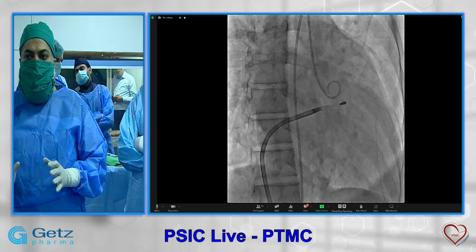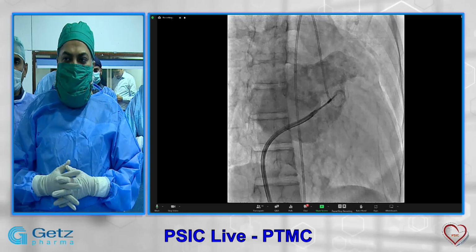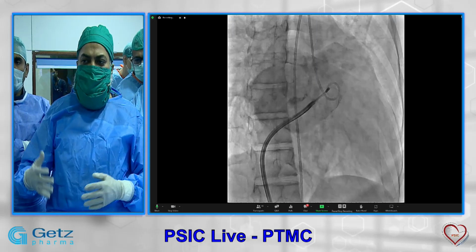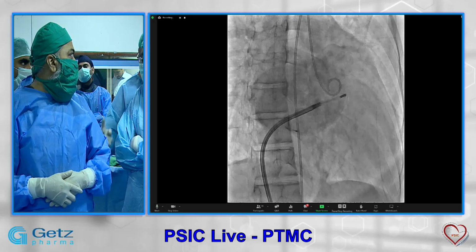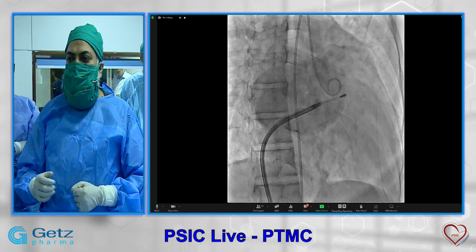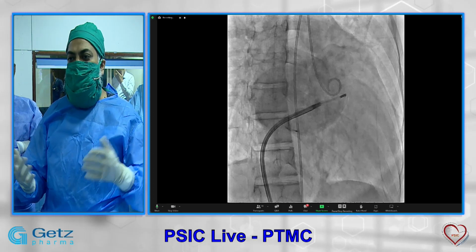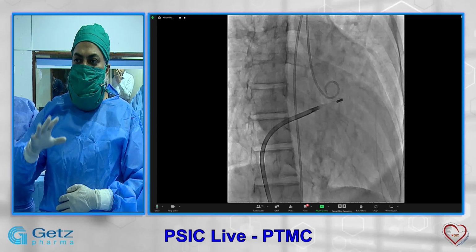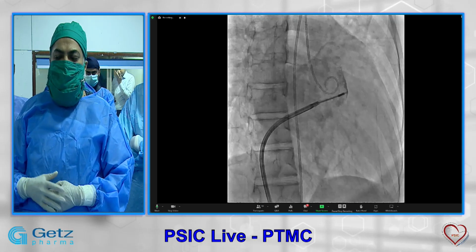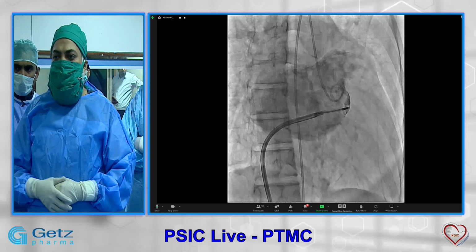So this is just for the juniors to understand how our LA looks. We don't see the LA because we don't see injections, but we can understand. Once we were juniors, our seniors used to say, now it's in the appendage, now it's in this part, and we used to wonder how they knew. But if you see these kinds of images, you will have this kind of understanding. Next, please.